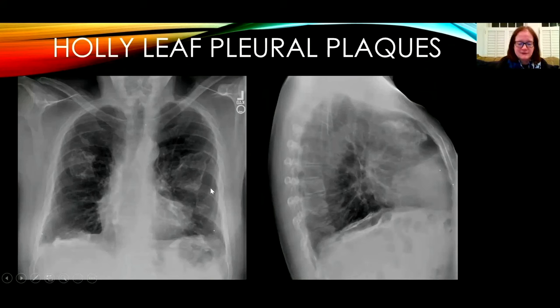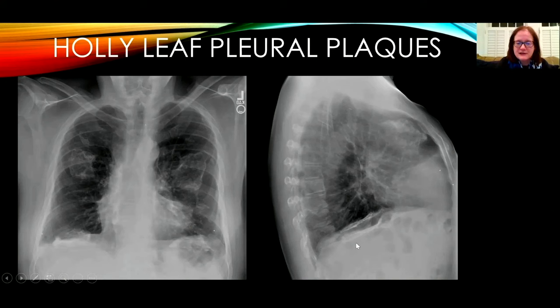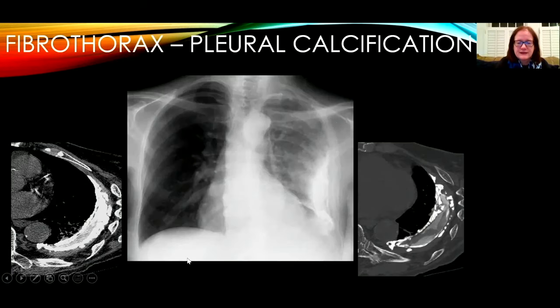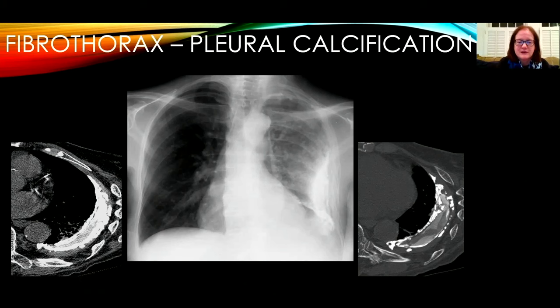Sometimes pleural plaques can calcify, as in this patient with holly leaf calcified pleural plaques — bilateral calcified pleural plaques seen in the setting of previous asbestos exposure. Typical locations include upon the hemidiaphragms and the medial aspect of the chest. This patient has extensive calcification of the pleural space on the left, known as fibrothorax. CT with lung window, bone window, and soft tissue window settings shows calcification of the visceral and parietal pleura with a decrease in volume of the left hemithorax. Fibrothorax can result from previous hemothorax or from empyema with histoplasmosis or tuberculosis infection.